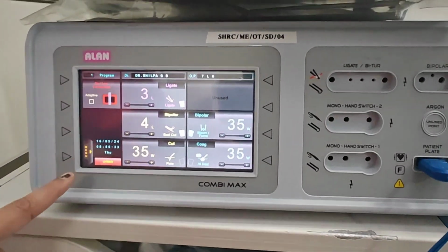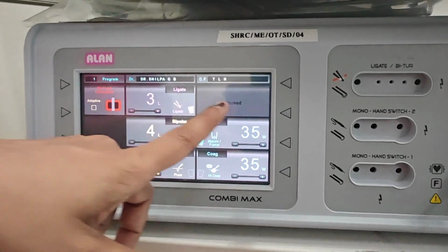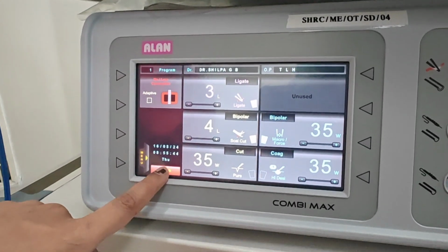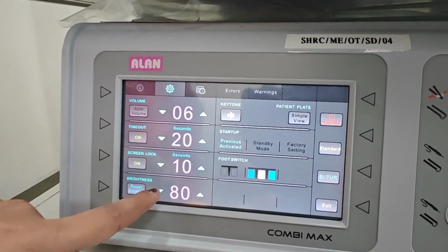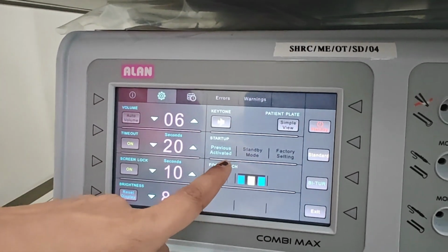This is the Alan Electrosurgical Unit where there is both monopolar and bipolar. This is the screen. You can see a menu button, and this screen becomes activated only once we unlock it. So now I'm pressing the unlock button and then I'll go to the menu. There are various parameters like volume, screen lock, brightness, which can be adjusted.